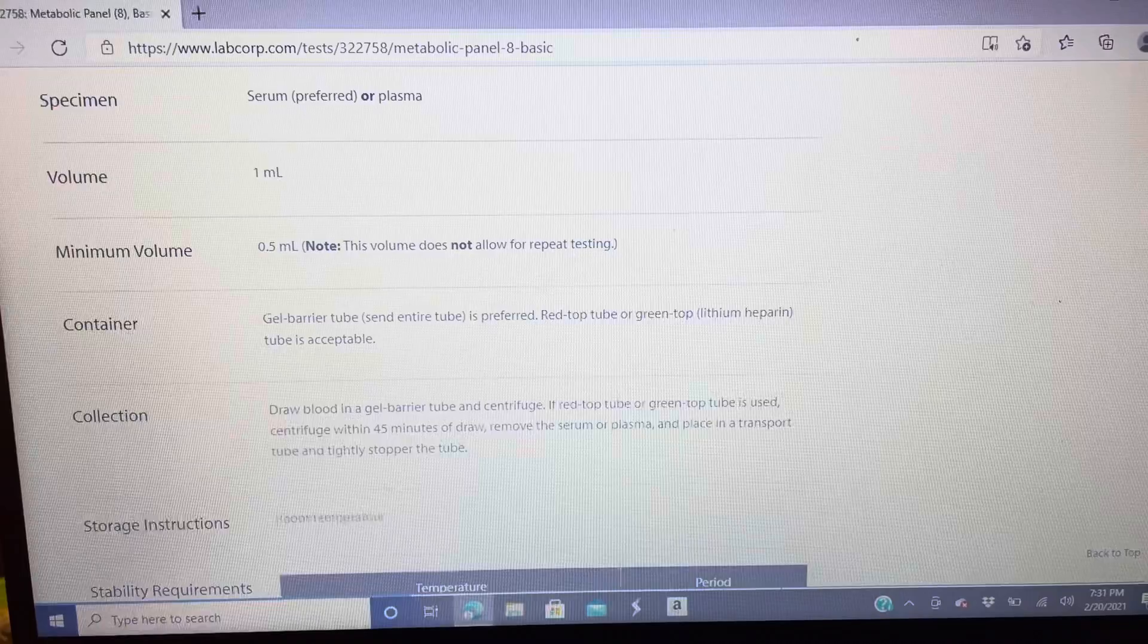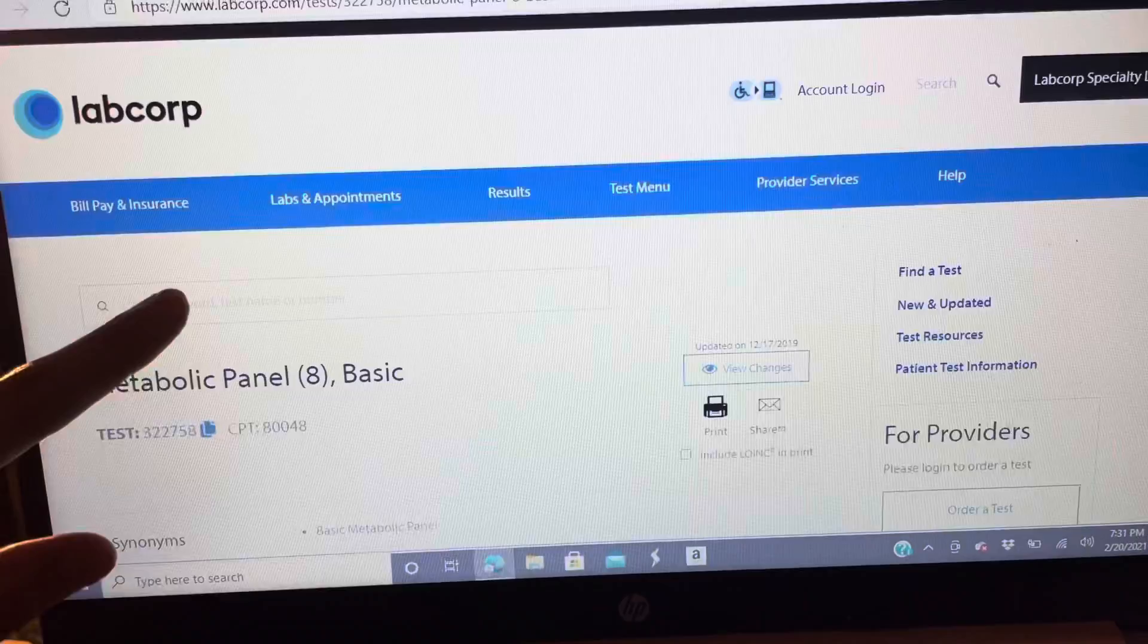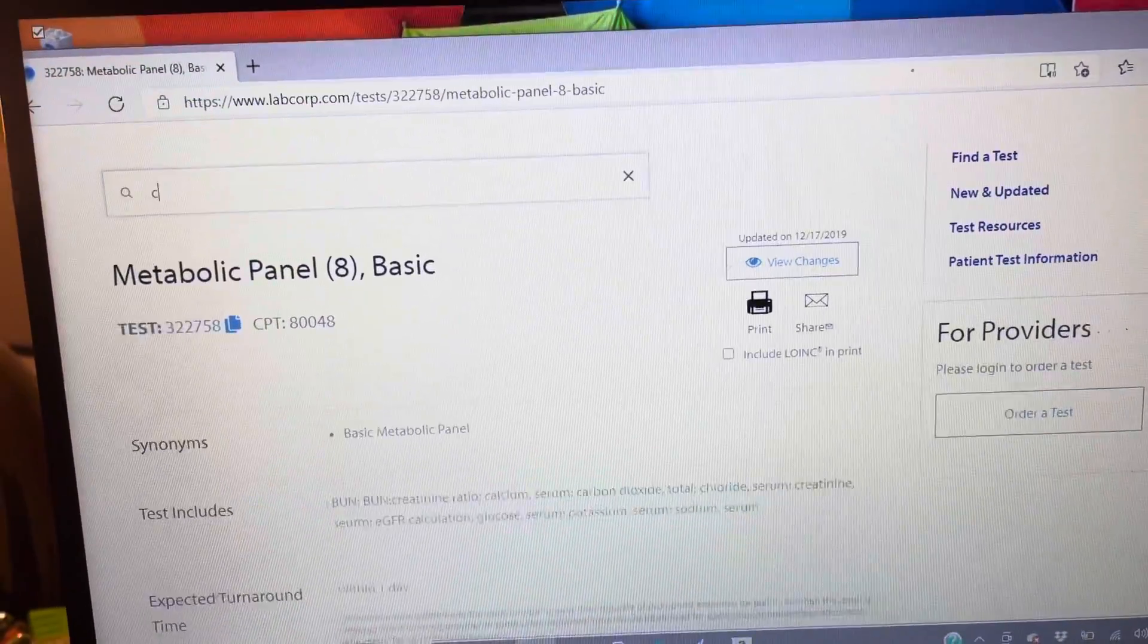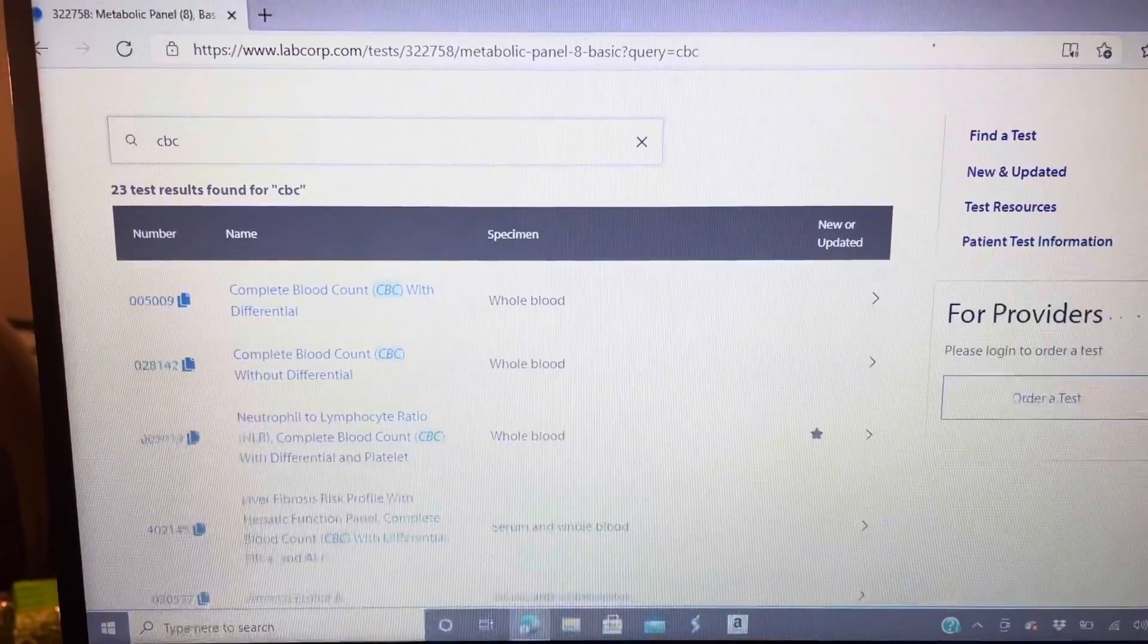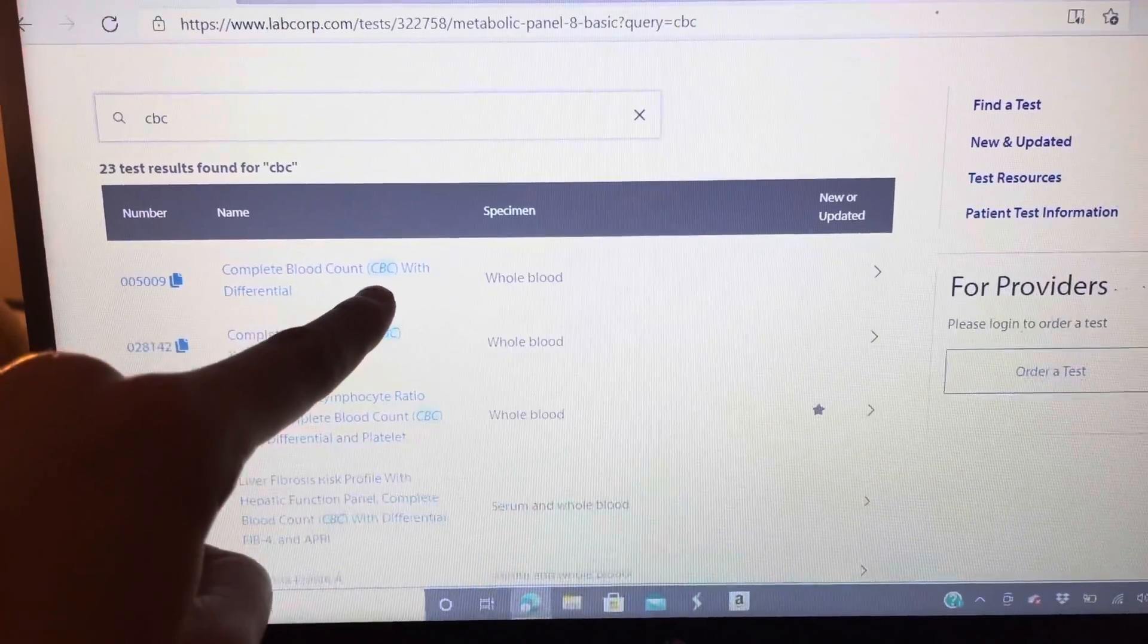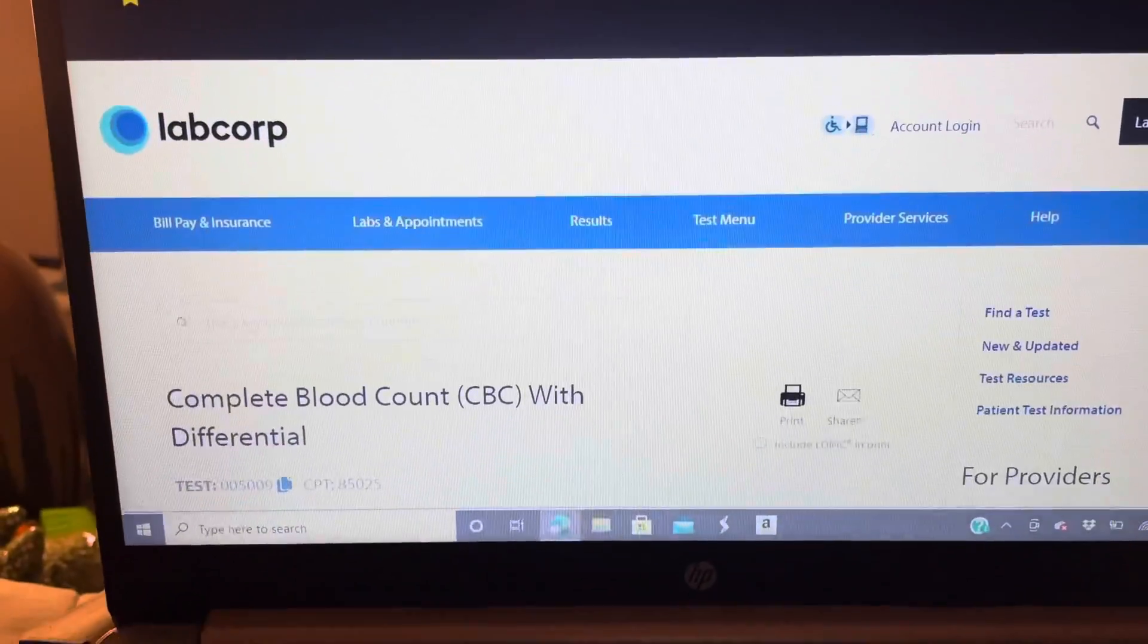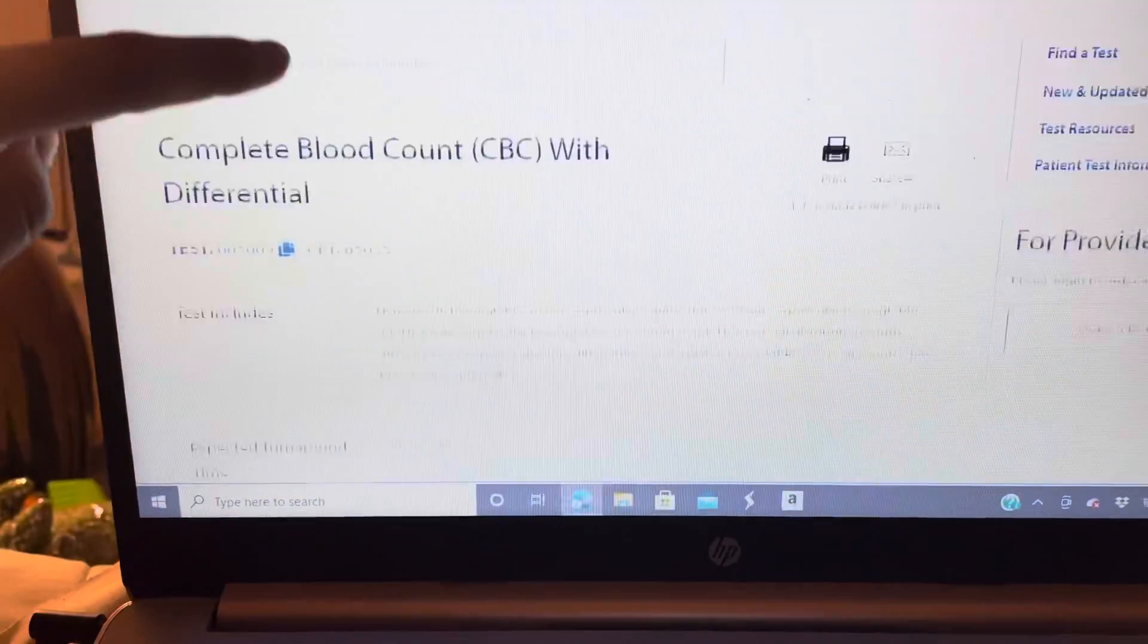We're gonna go back up, we're gonna type in another test. We are gonna type in a CBC, CBC, and it pops up first. CBC, we're gonna click on that for information: complete blood count, CBC.